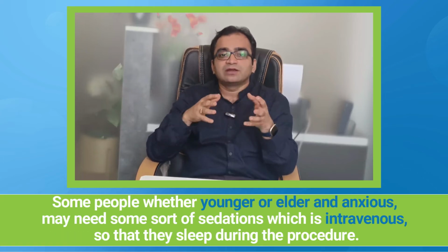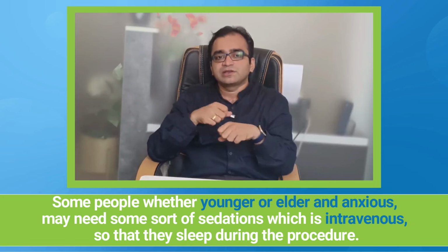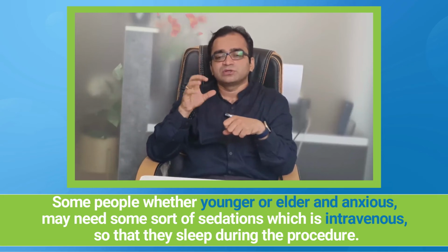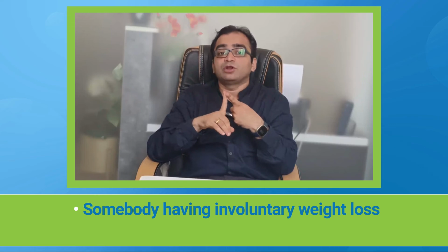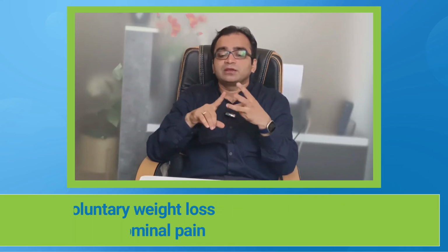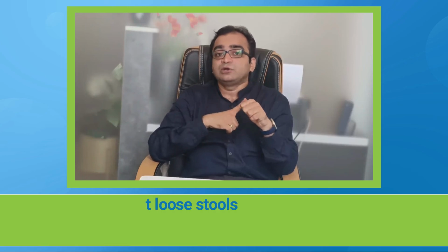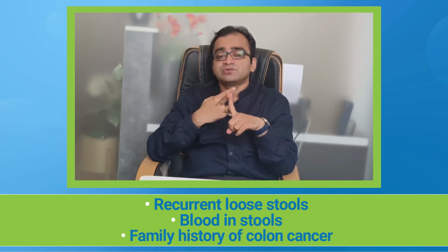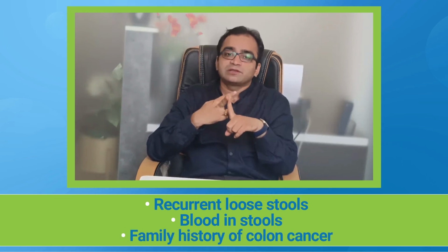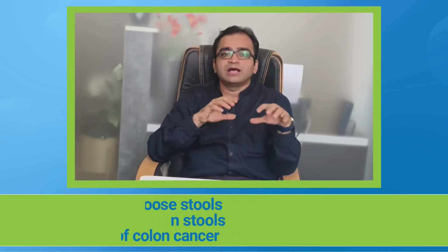Some people who are very young or very old and very anxious may require some sort of sedation which is intravenous. By vein, we give some sedation so that they sleep during the procedure, and it can be done that way also. The lower GI, who requires a lower GI endoscopy? Somebody again who is having involuntary weight loss, recurrent abdominal pain, low grade fever, suspicion of intestinal tuberculosis, recurrent loose stools or blood in stools, or somebody who has a family history of colonic cancer would require a screening colonoscopy or a lower GI endoscopy to rule out any of the pathologies we mentioned in the last few seconds.